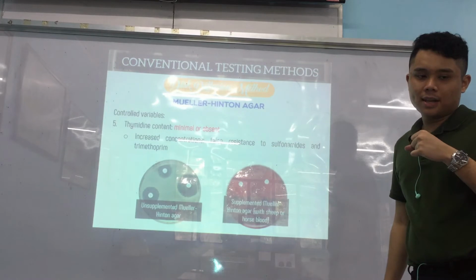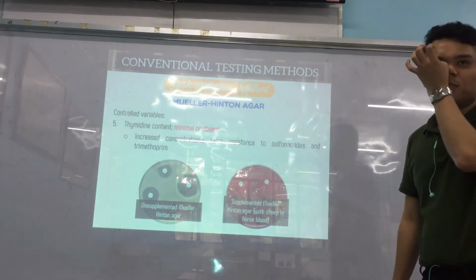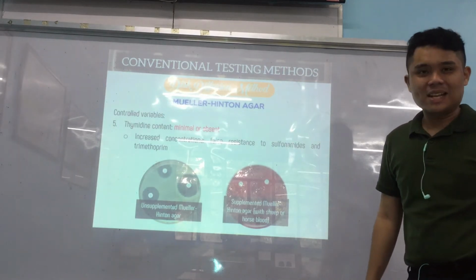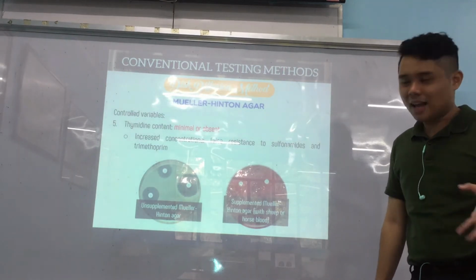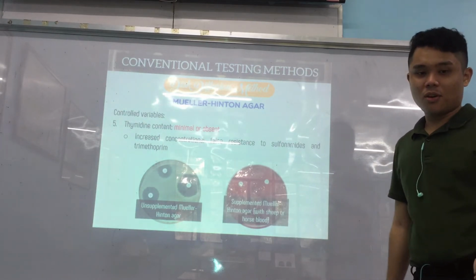Okay. So again, unsupplemented MHA, it's usually most common, good for ginagamit sa bisag kinsa na organism. So like basta any organism. Pero kani again supplemented is usually for mga fastidious. Okay? All right.